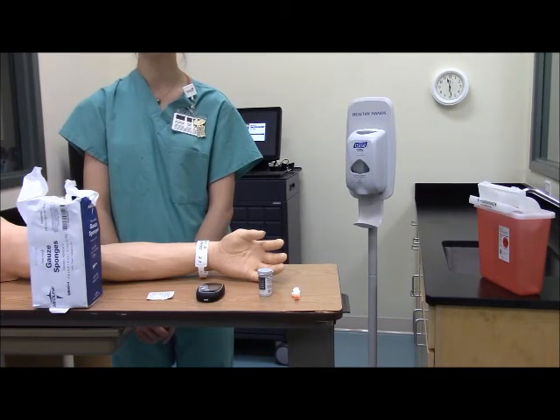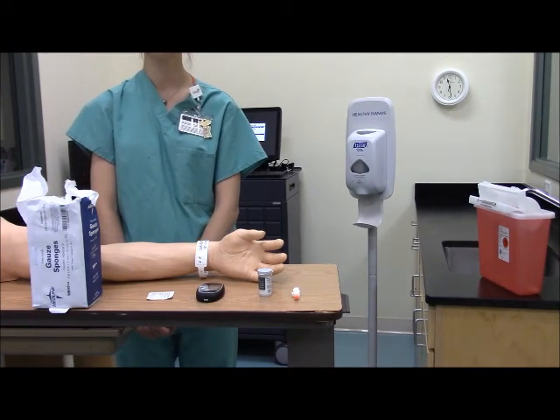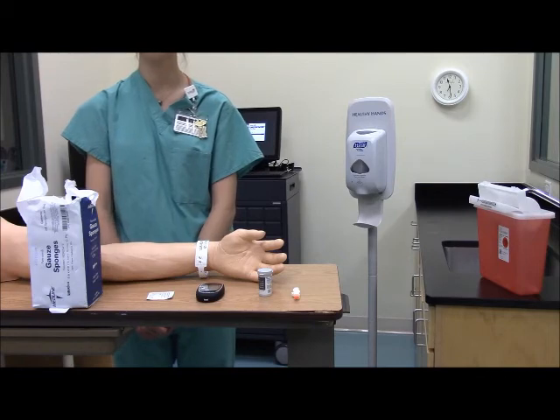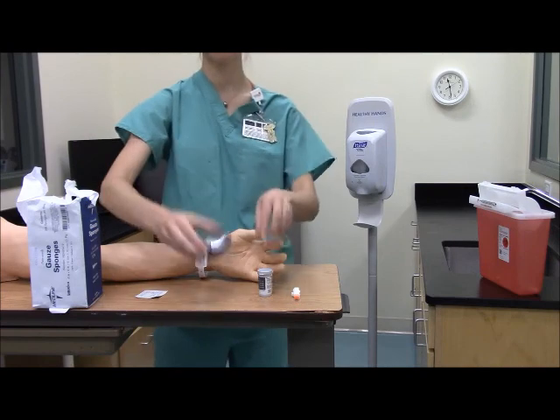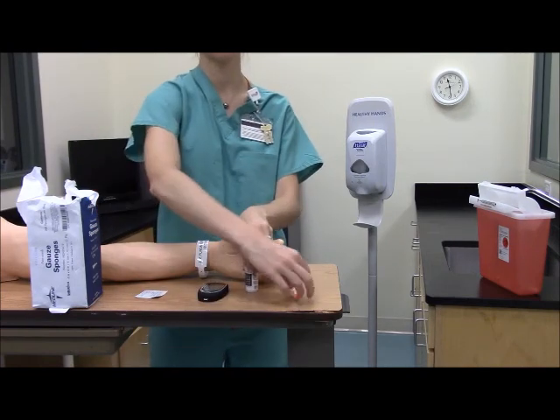This skill is obtaining a capillary blood sample for glucose testing. First you're going to gather your equipment, which includes gauze, alcohol pad, your monitor, your test strips, and your lancet.